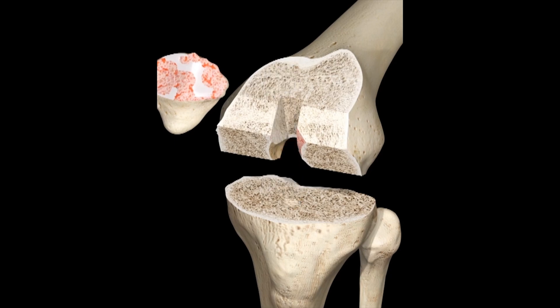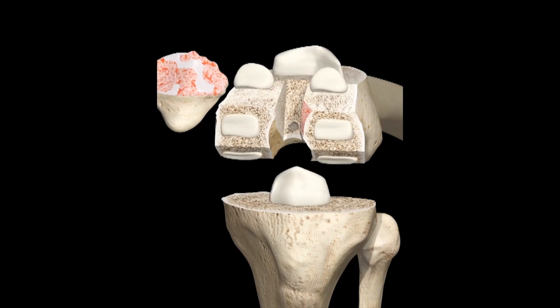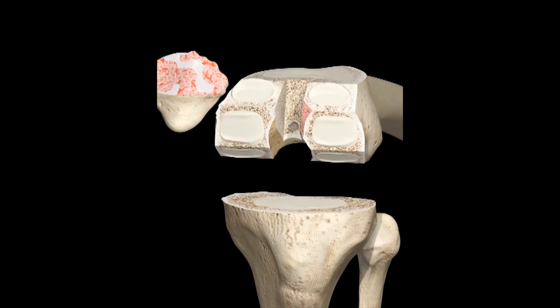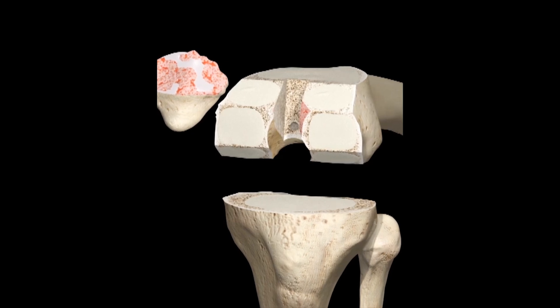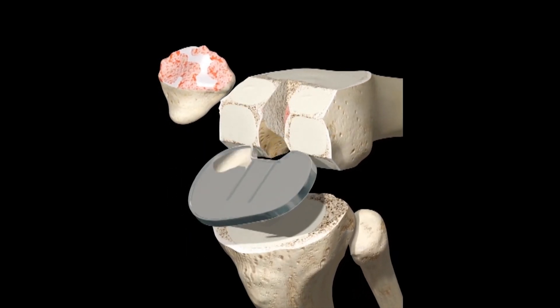Holes are drilled into the bones to allow for placement of metal components. Replacement metal articular plates are then fixed to the bones using polymethyl methacrylate cement.